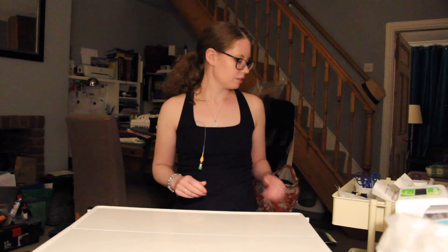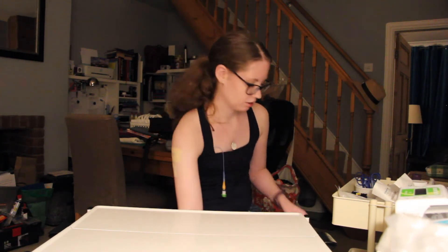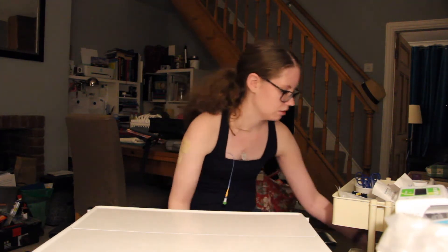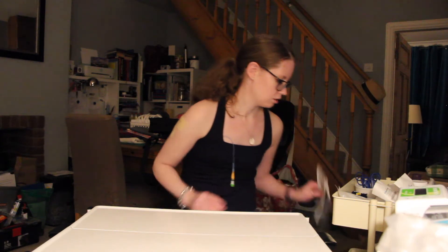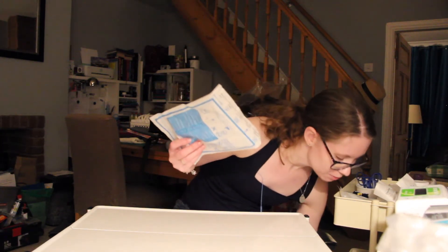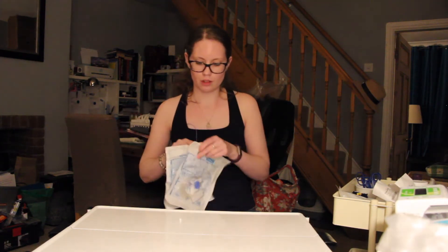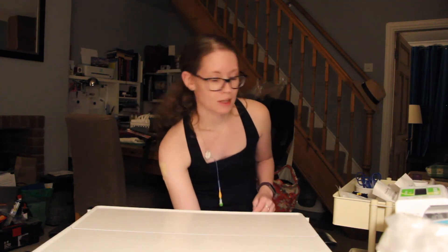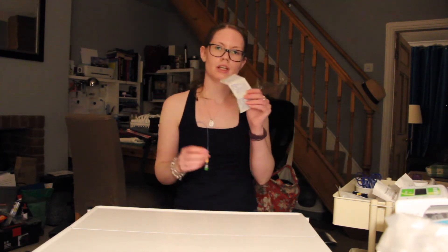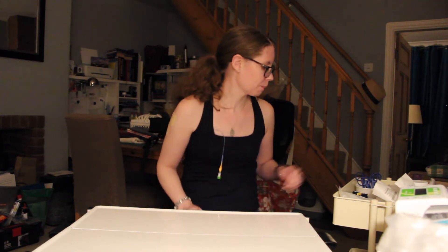Next thing I need to do is collect everything from the trolley that I need. So we've got a flush, two dressing towels, two pairs of gloves, the double spike, and the set that it joins to go in the pump. I've got my two bags of fluid, and then I just need three more sanicloths and some tape.